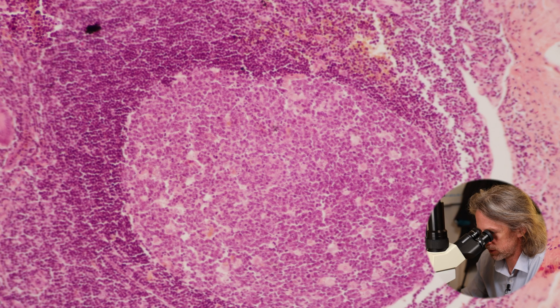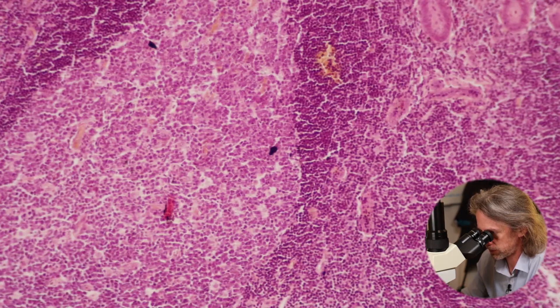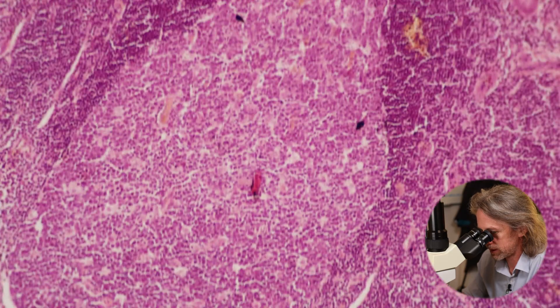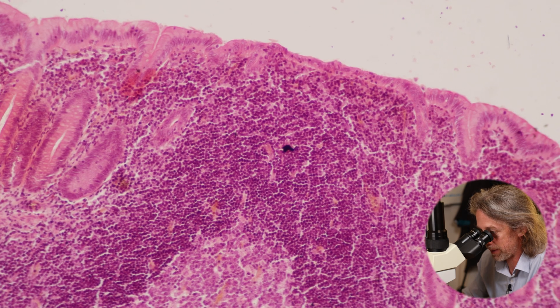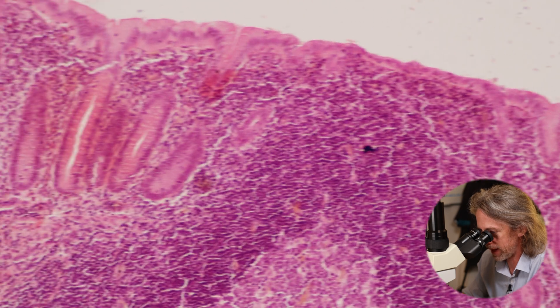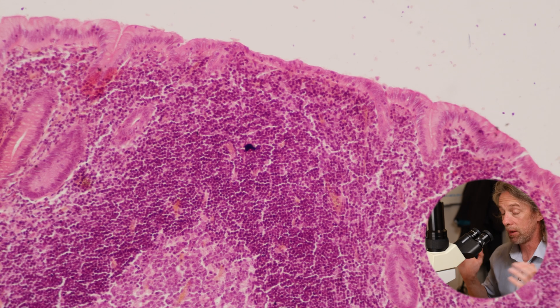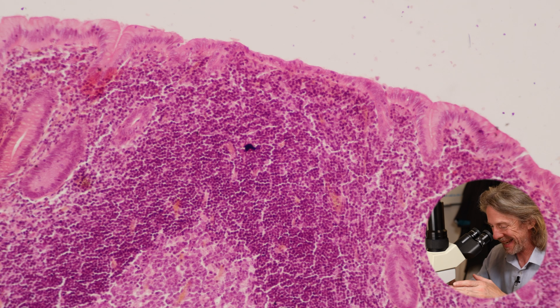One other thing to look for: with these lymphoid follicles, there's a good one — a lymphoid follicle right up against the epithelium of the lumen. Whereas we have intestinal crypts over here, we don't have them where the follicle meets the epithelium. If you think about the cells of the immune system, they need to be able to communicate and monitor whatever is in the lumen. So here we should find what are called M cells.